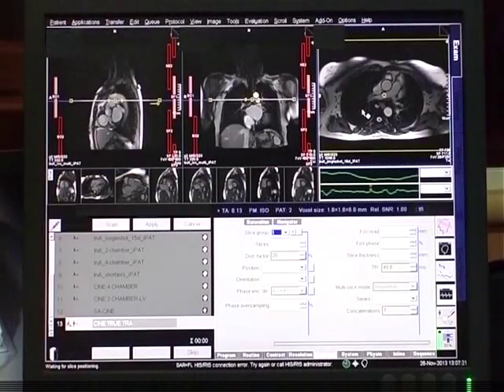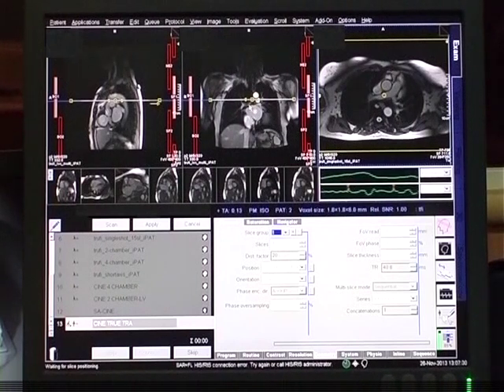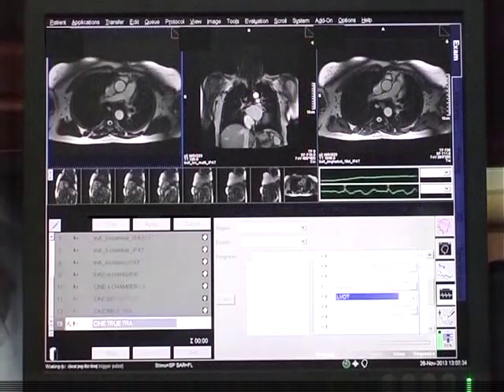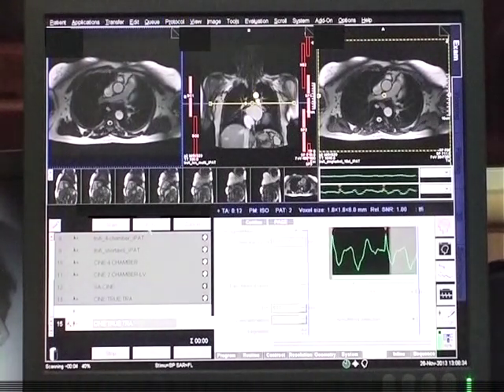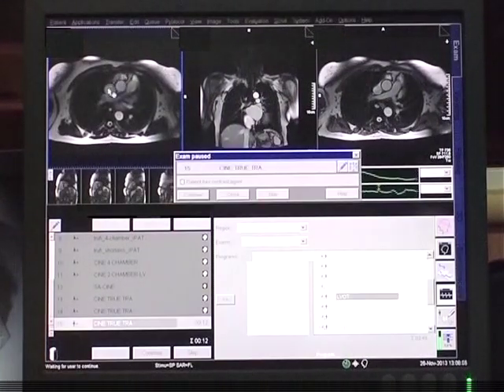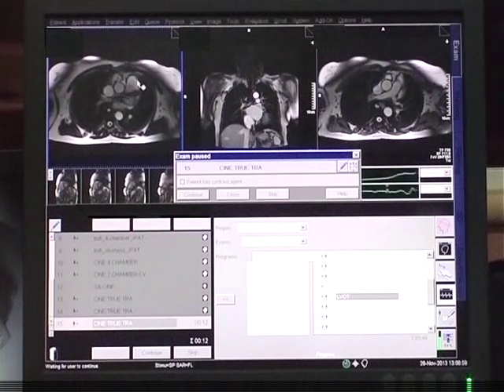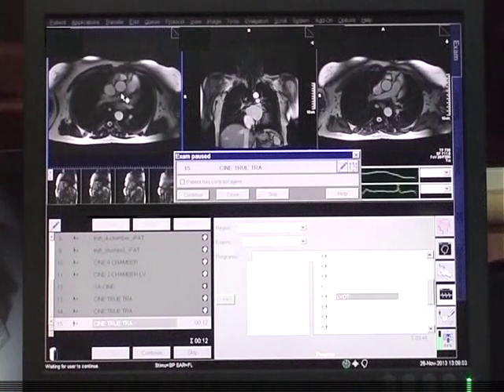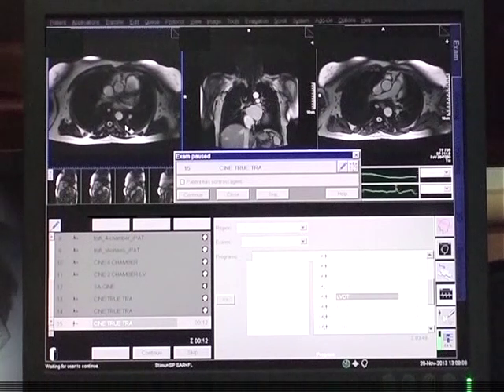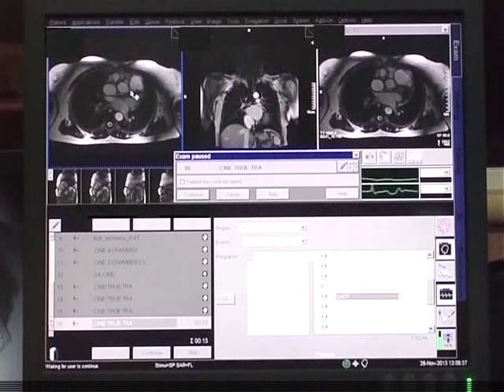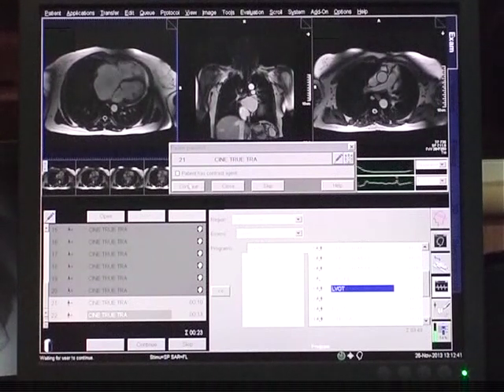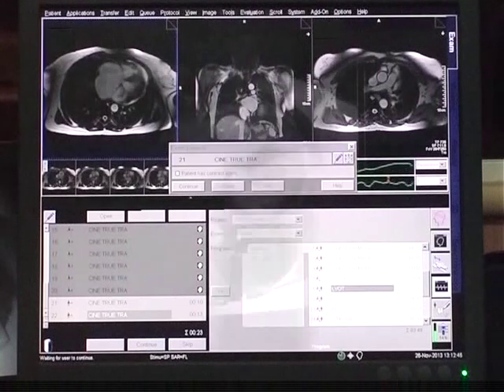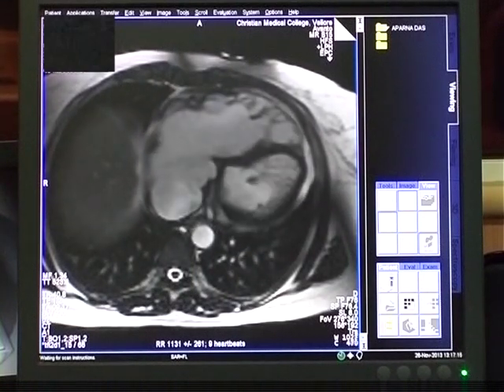True axial cine images are taken from the base of the heart to the apex in all patients suspected with ARVD, because the RV free wall is best seen in this sequence. Visible structures include the SVC, the ascending aorta, the RVOT, the right pulmonary artery, and the descending aorta. The RVOT is dilated, the right atrium and right ventricle are moderately dilated with crinations on the RV wall, and there is focal aneurysmal outpouching and areas of dyskinesia.